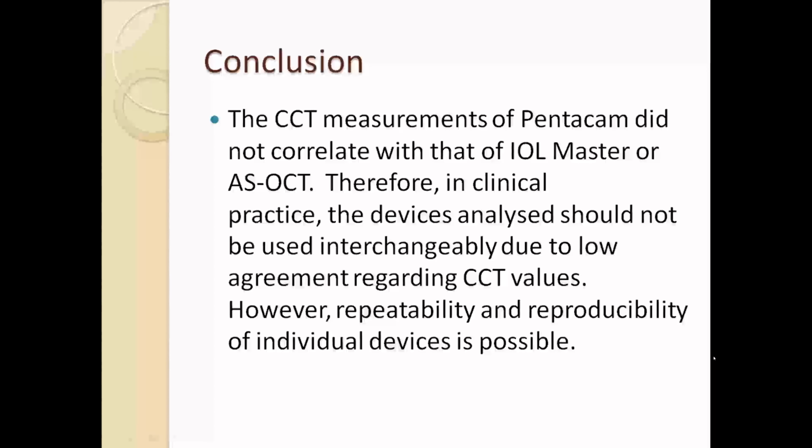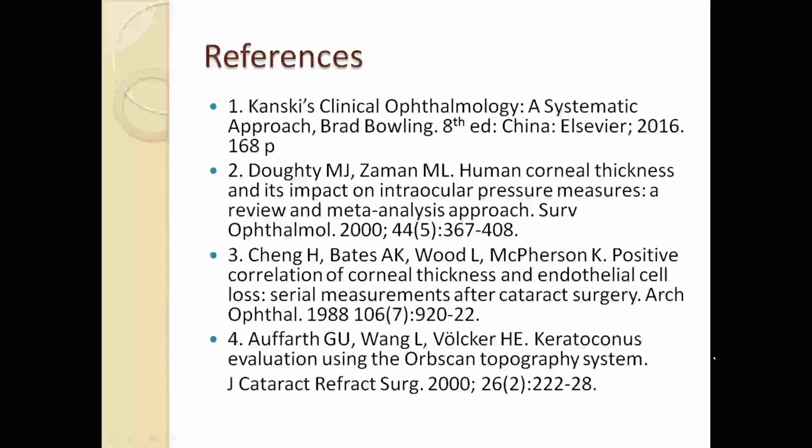Conclusion. The CCT measurements of the Pentacam did not correlate with those of IOLMaster or ASOCT. Therefore, in clinical practice, the devices analyzed should not be used interchangeably due to low agreement regarding CCT values. However, repeatability and reproducibility of the individual devices is possible. These are my references.